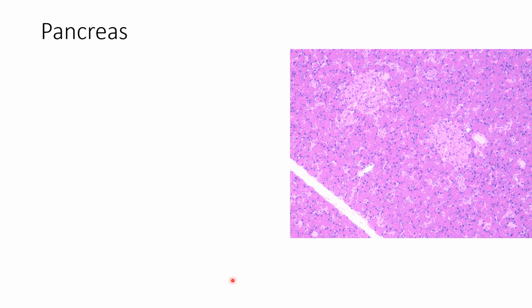Okay, this is the pancreas. You can kind of tell the pancreas from everything else because it has these islands that are highly cellular. They are completely made of cells. You can tell that they are made of cells because if you look inside, you see a bunch of nuclei, which is a hint that it is cellular. Whereas the thyroid follicles we were just looking at, the inside is filled with a smooth pink jelly because there's no cells in there.